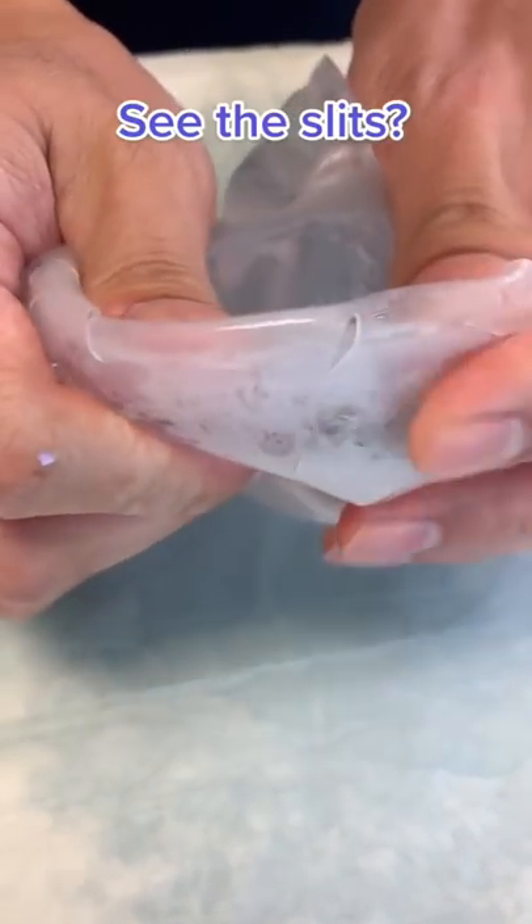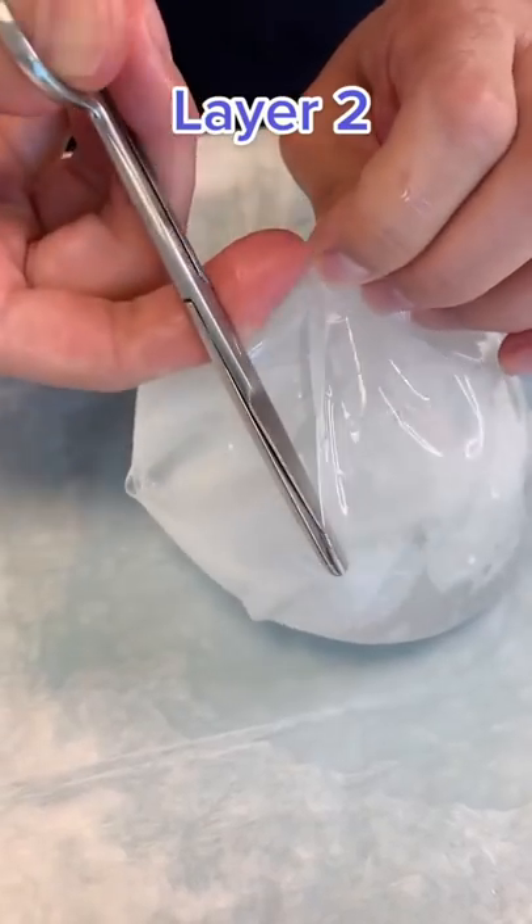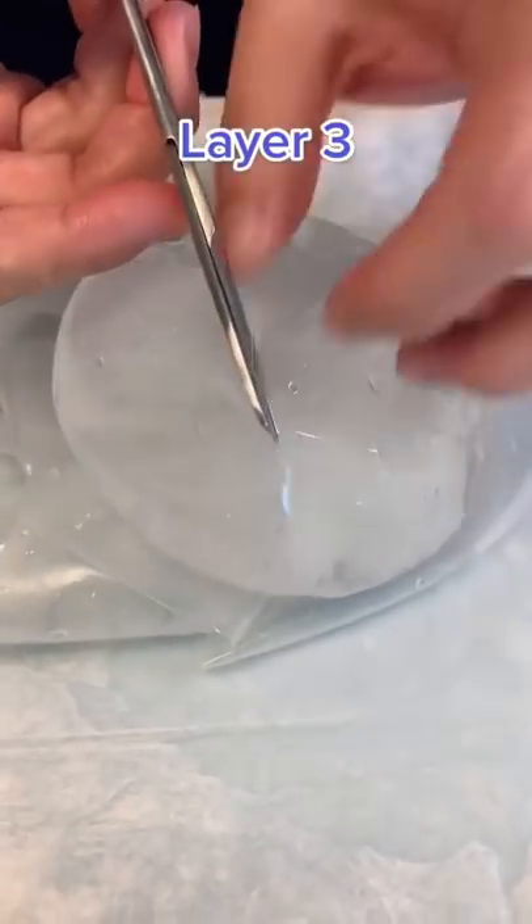These tiny slits allow the saline to redistribute inside the various layers. Now I'm cutting through the second layer — as you can see, it's like peeling the layers off of an onion.